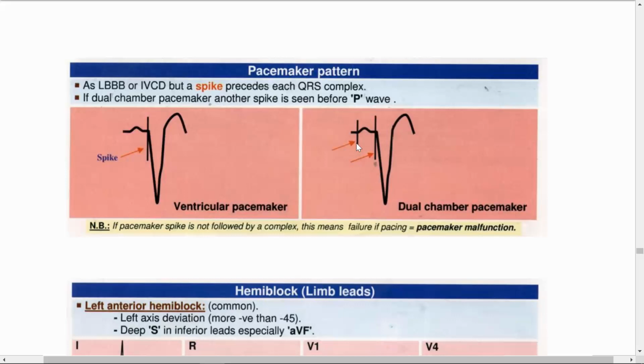Do we need a sensor all the time? Yes, one lead in the right atrium and the mode AAIR. If, for example, the SA node is not working at all, yes, AAI. Why do we need the sensor if it is not working? The sensing is in the same lead, in the same lead. Okay?